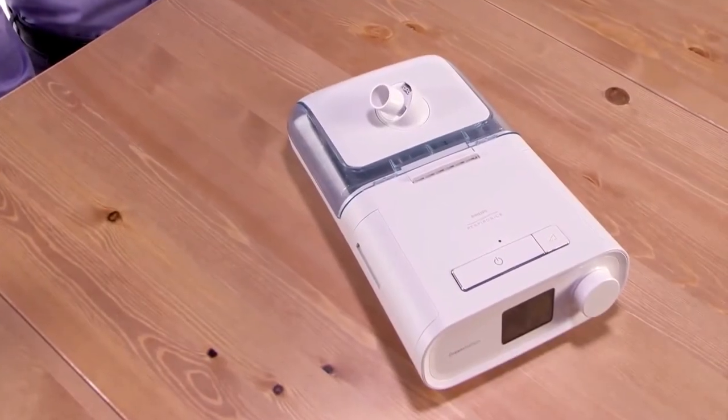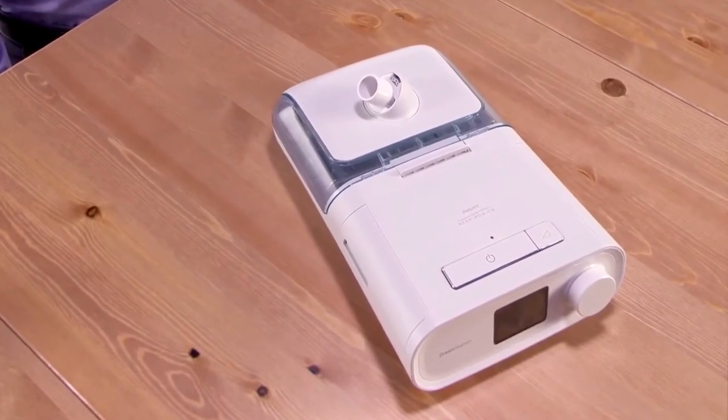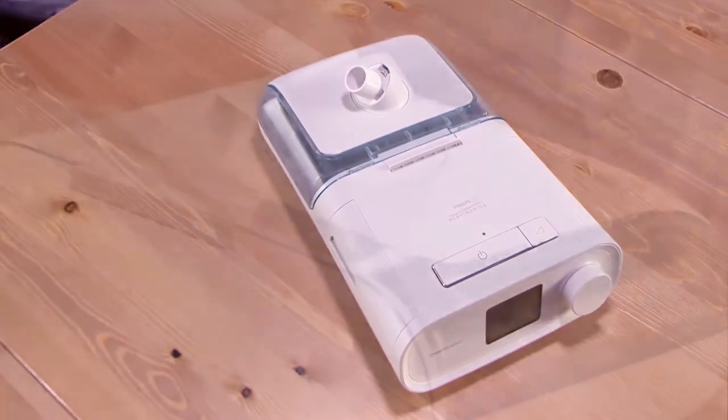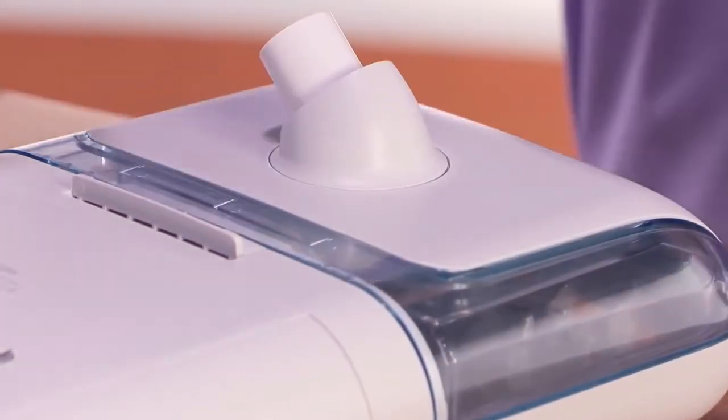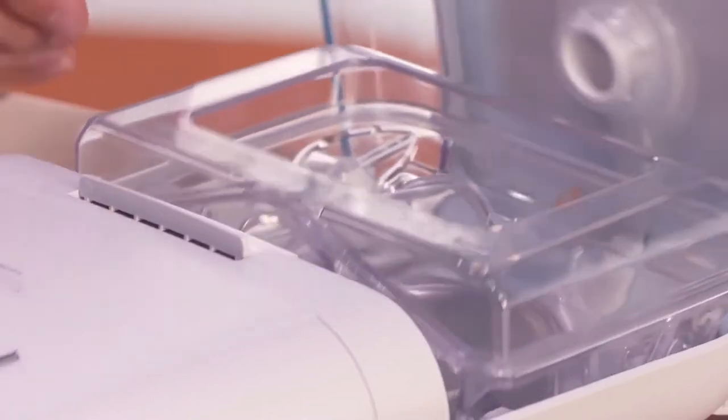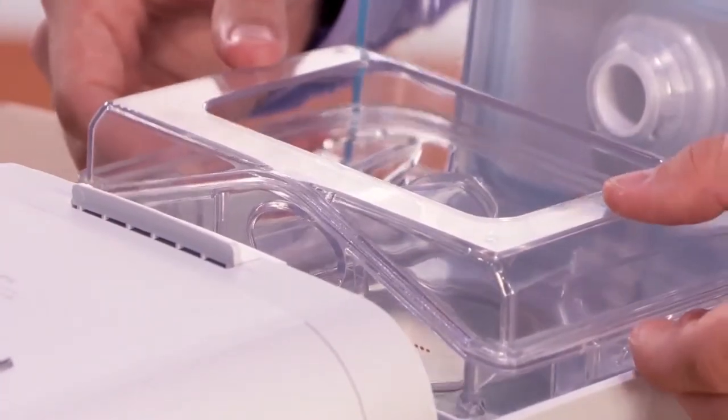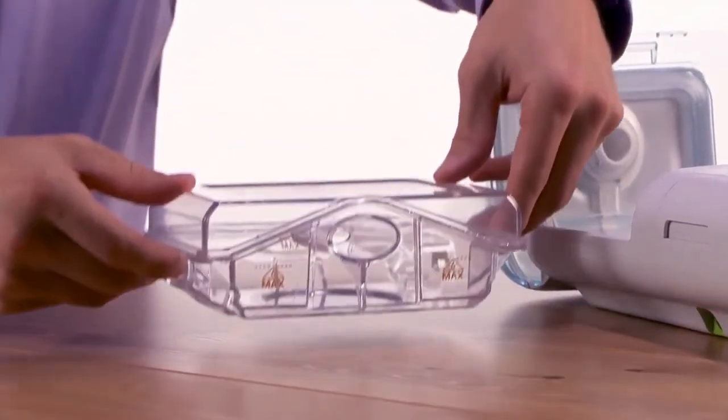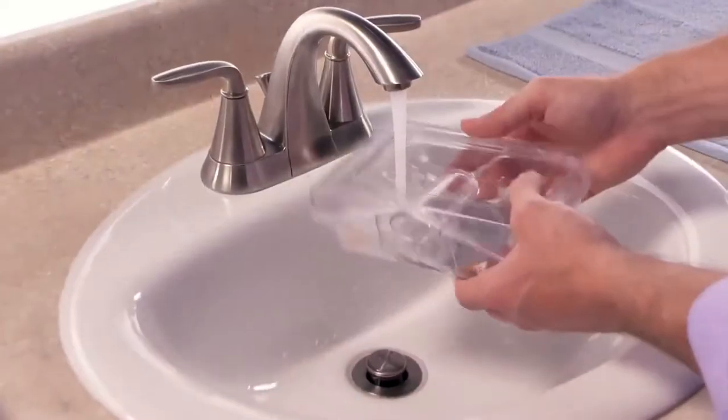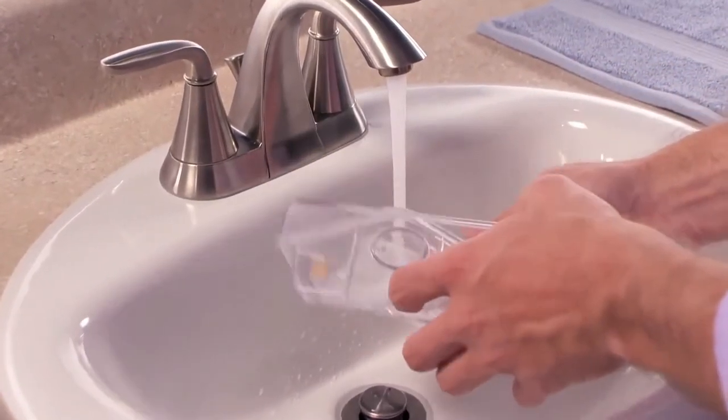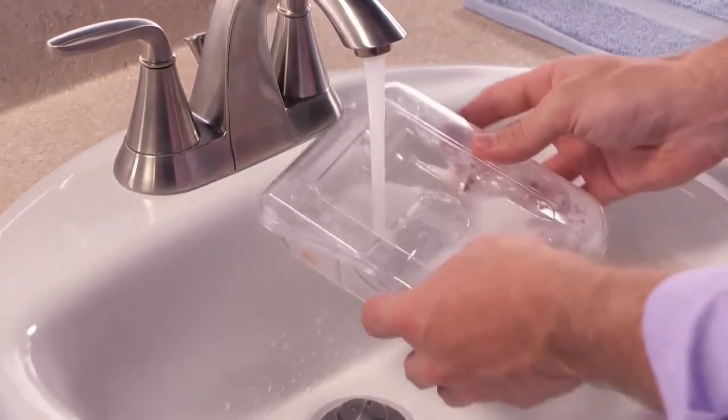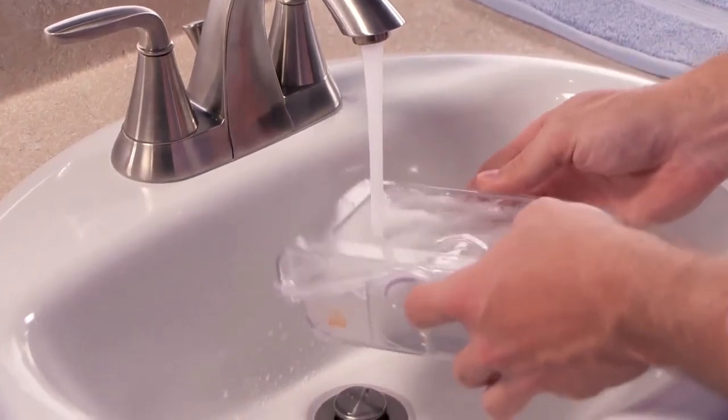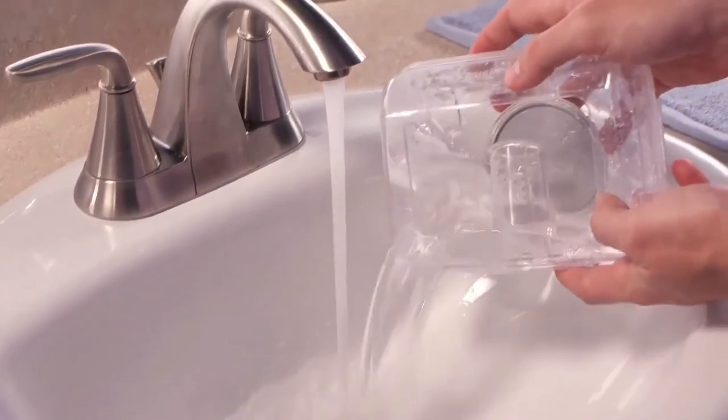You should fill your humidifier water tank with distilled water each night before you go to bed. Slide the humidifier release latch toward the therapy device while simultaneously lifting the lid up, swinging it completely open. Remove the water tank. Clean the water tank before first use by rinsing with tap water. Each subsequent night of use, empty any remaining water and rinse the tank as needed before filling.